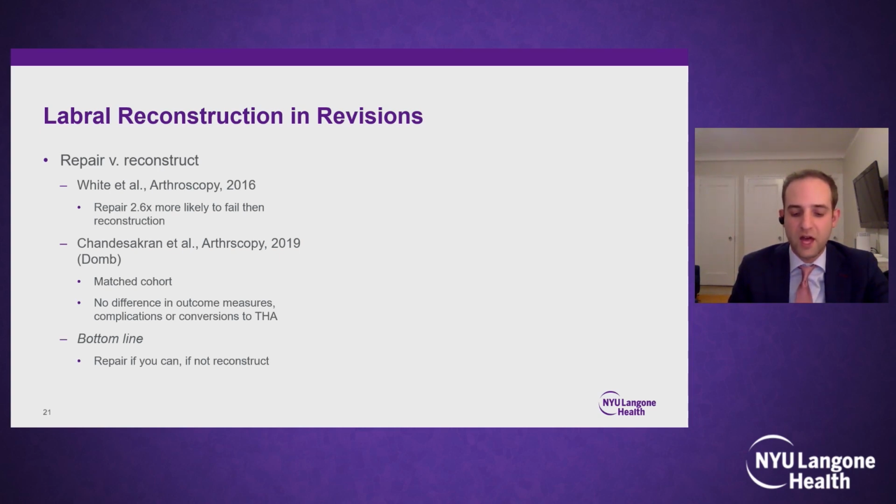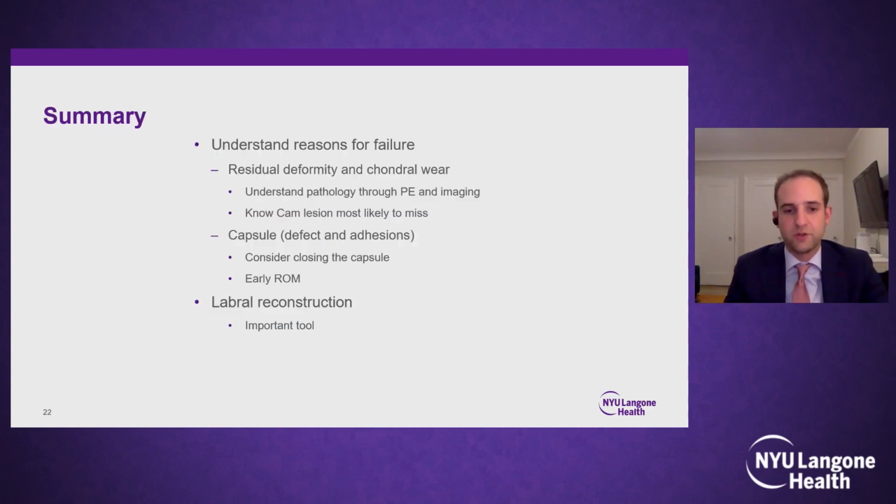My opinion here is that you do what you can. If you can repair, then that's fine and technically probably simpler. But I would probably have a low threshold, especially in a degenerative or calcified labrum. Reconstruction can be a good outcome and a useful part of the arthroscopist's tool bag.